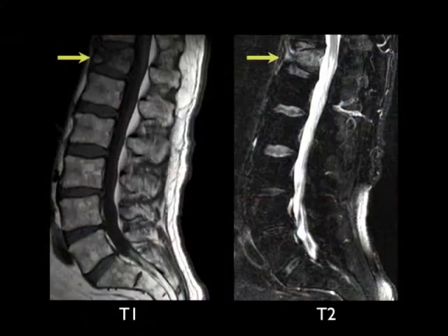Look at this vertebral body — it has abnormal signal in it. It's compressed. That's a fracture. It's harder to see on an MRI, in a way. It's easier to see on that plain x-ray. It just looks like the vertebral body fractured.